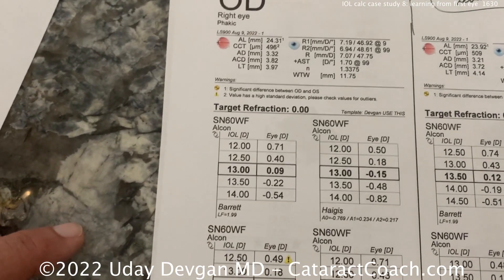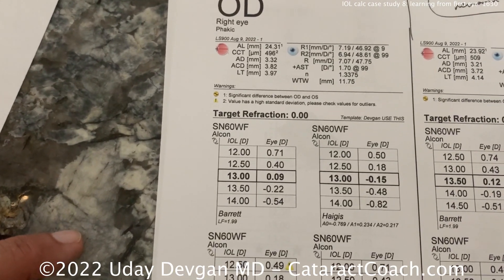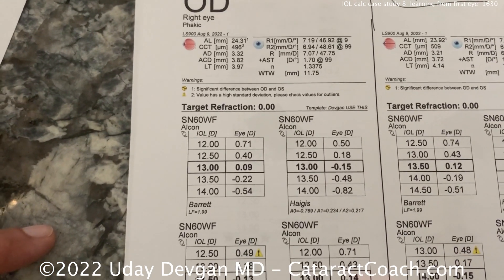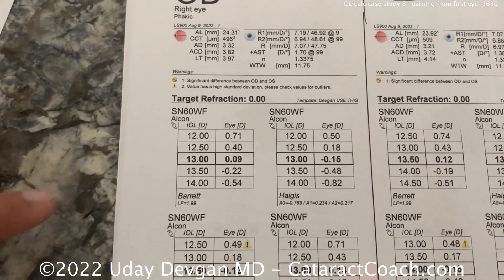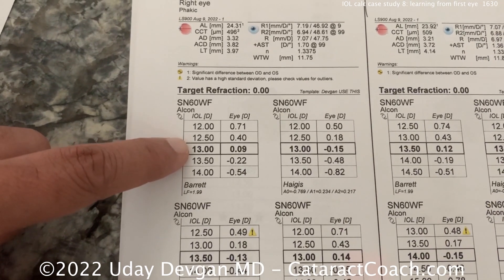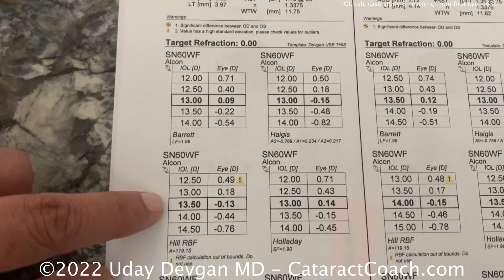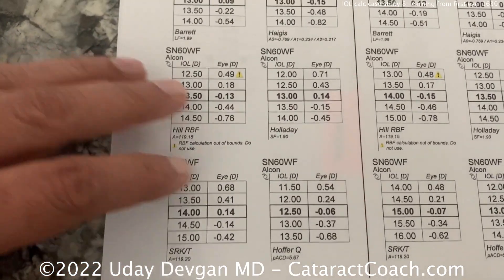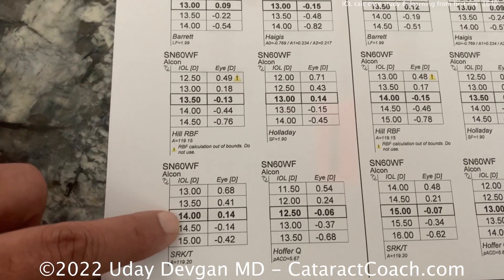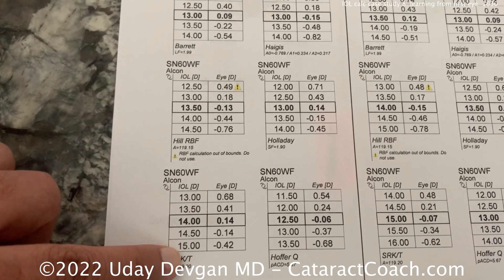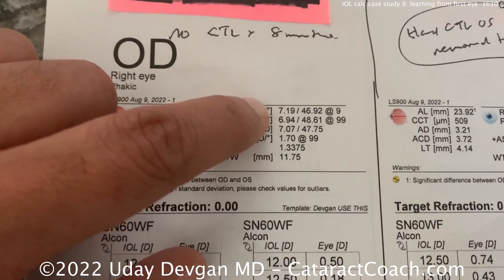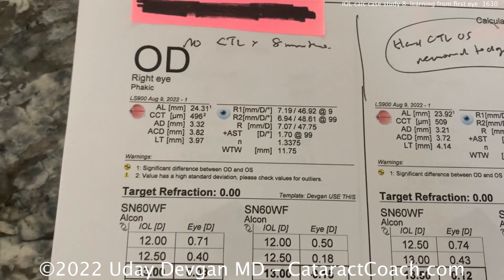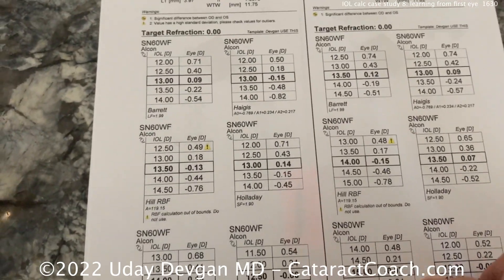Let's look at the right eye, because that's the one we're going to operate on. The patient wants an extended depth of focus lens. Looking at Barrett formulas, you'd probably choose 13 or 13.5. Hill the same, Holladay 13 — all pretty consistent. We don't use SRKT here because the K values are unusual; this patient has Ks as high as almost 49, 48.6. So we want to avoid SRKT in this eye.